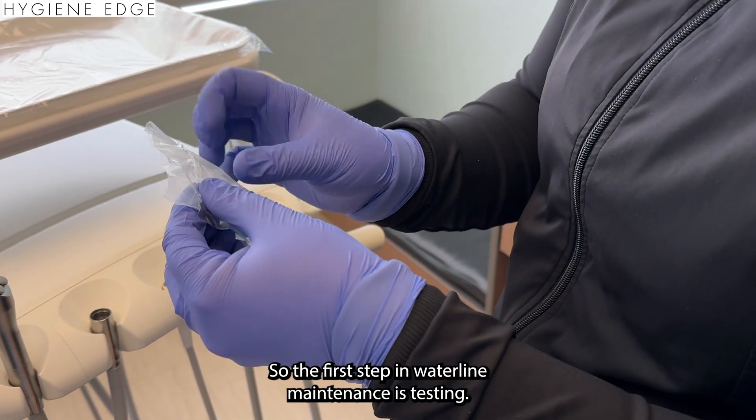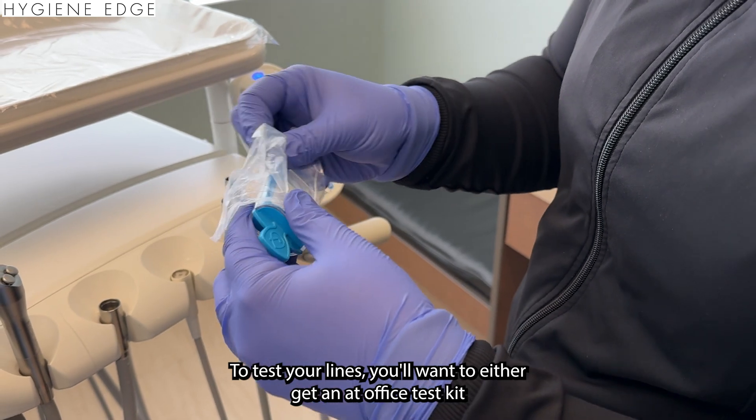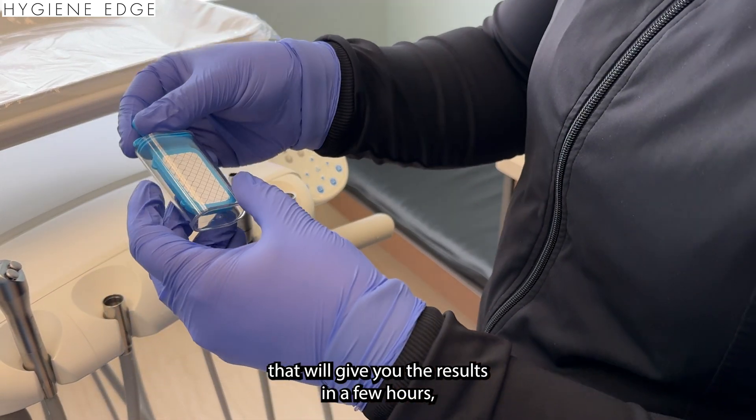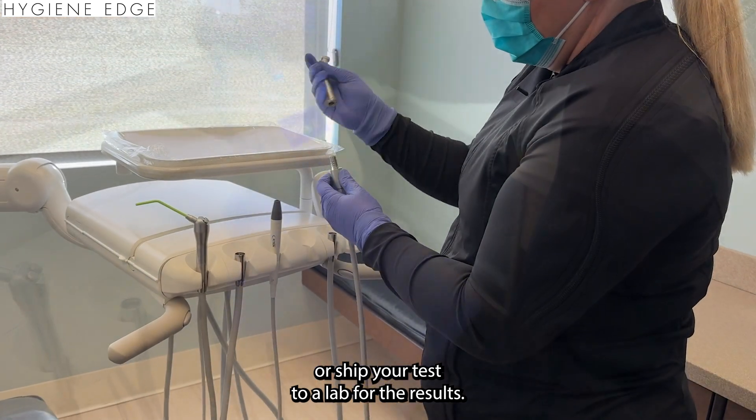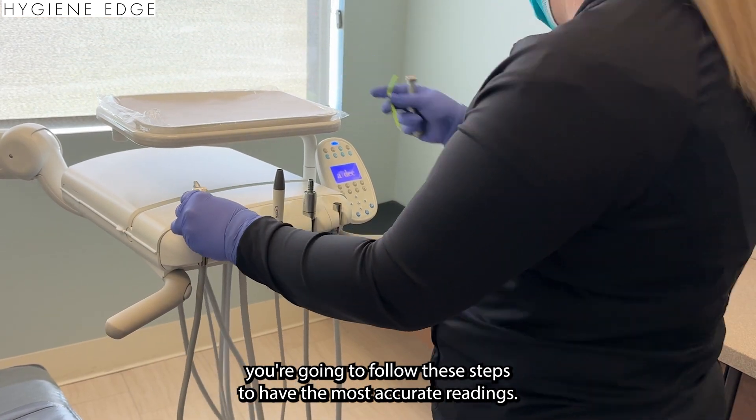The first step in waterline maintenance is testing. To test your lines, you'll want to either get an at-office test kit that will give you results in a few hours, or ship your test to a lab for the results. After getting your test kit, follow these steps to have the most accurate readings.